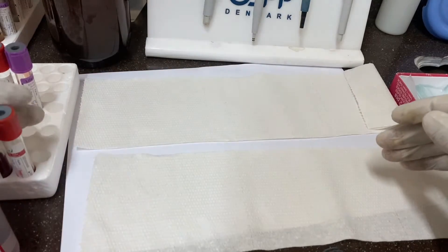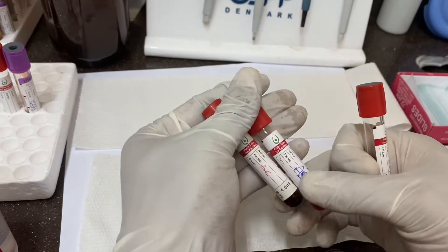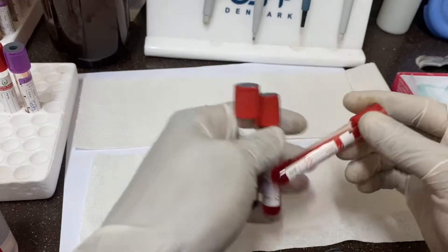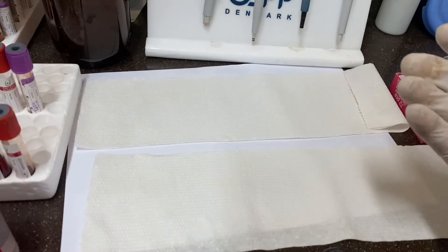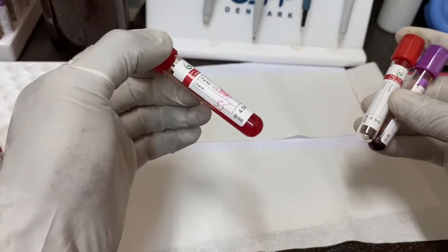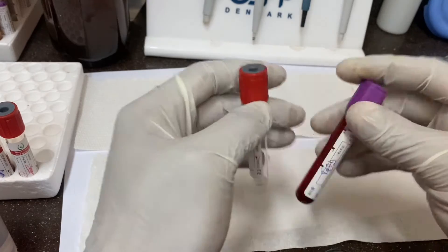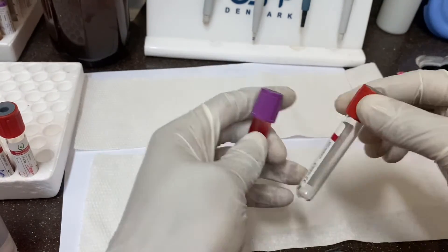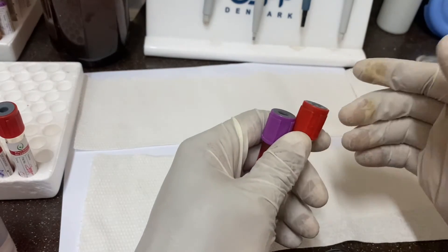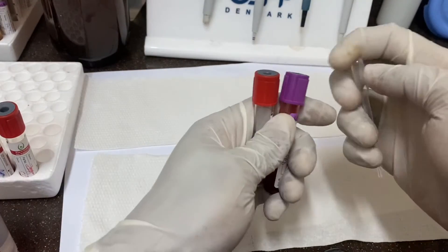To run the test you need your controls. I have three controls: the SS control, the AS control, and the AC control. We prepare these in a very simple way — you take about three drops of blood, add six drops of tap water, mix, and get your hemolysate. We know the genotypes of these controls already. For the patient sample, we don't know the genotype, so I will take three drops of blood, add water to lyse the red blood cells, and release the hemoglobin so that it can migrate.